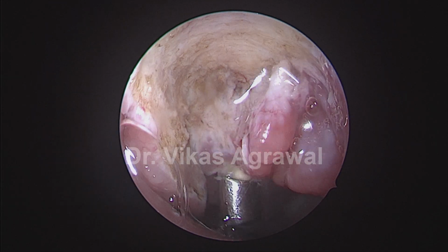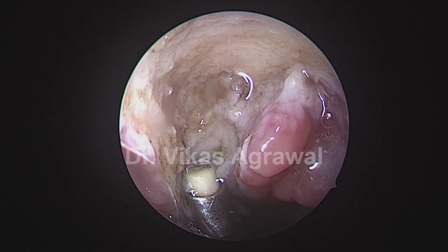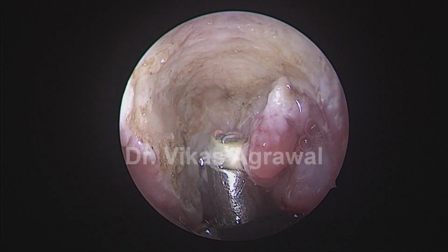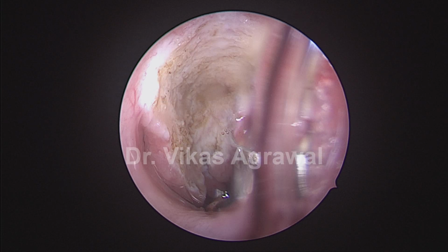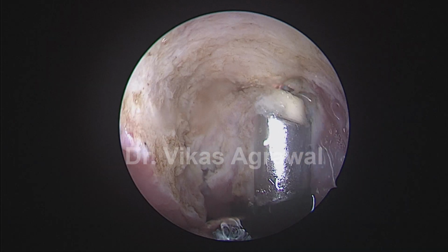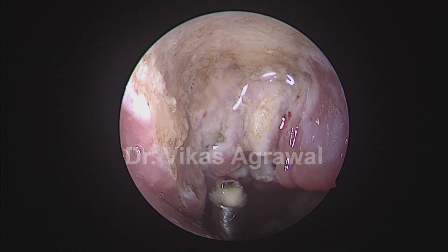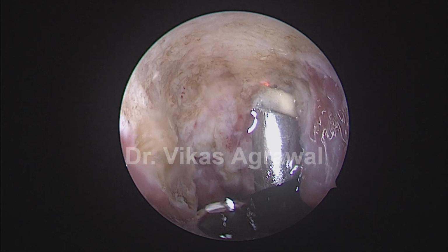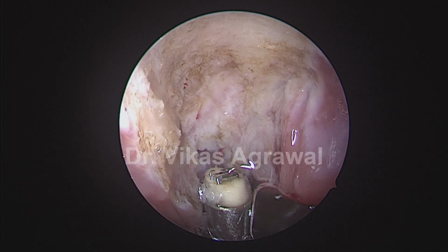Let me debulk some more tissues so that I can clearly define the boundaries on the posterior and the lateral aspects. And you can see how much of lymphoid tissues were blocking the nasopharynx. And it is impossible for the child to breathe with such a blockage. And all those changes in facial profile happens because of this blockage.